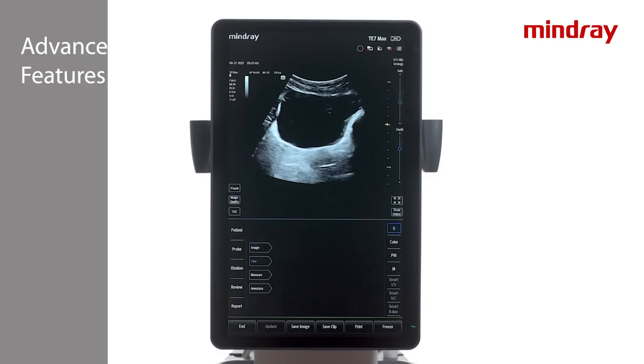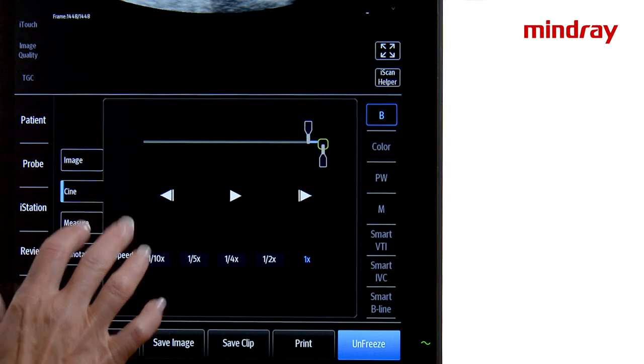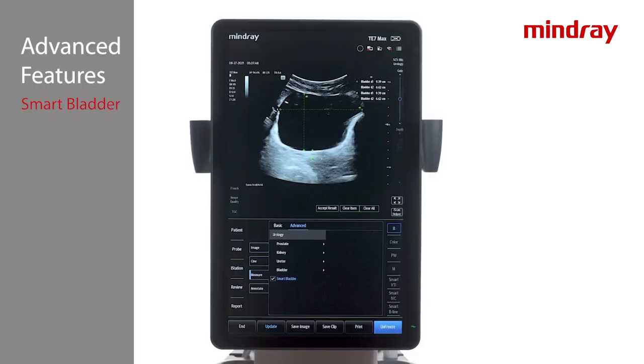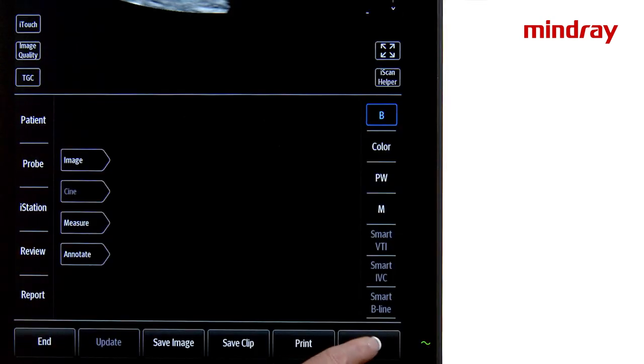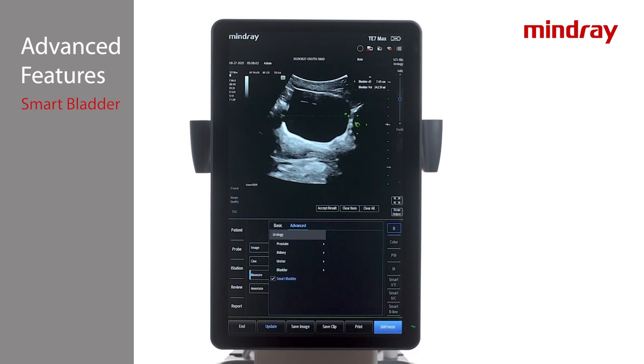Smart Bladder is an automated method of providing rapid and accurate bladder volume assessment. Obtain a view of the bladder in the transverse plane and freeze the image. Select Measure Advanced Smart Bladder. The system will automatically detect two planes and measure the distances. Unfreeze and obtain a longitudinal view of the bladder, then select Measure. The system will automatically detect the third plane and measure the distance as well as provide bladder volume data.